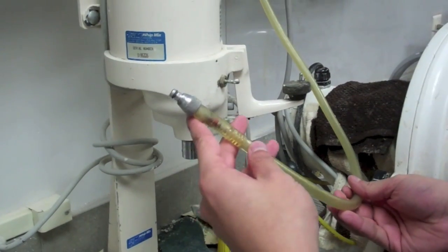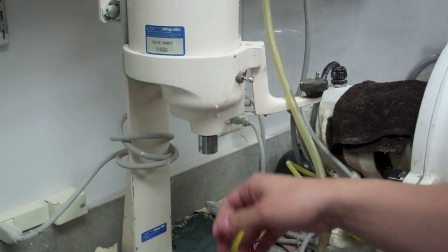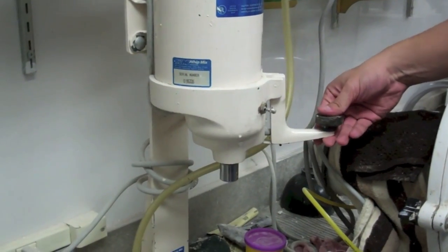This device contains a vacuum hose, an on and off switch, and a vibrator.